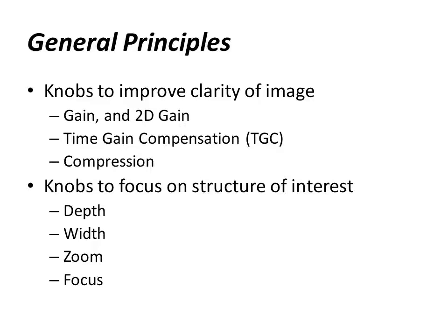So the general principles are that there are some knobs that help you improve the clarity of an image, whereas there are some other knobs which help you focus on the structure of interest. We are not going to go through the details of all of these. These are best explained at the time that you actually are doing an ultrasound by the bedside. So these will be explained better to you when you come for the course, but just to give you an idea, so that you know what you should be looking forward to.